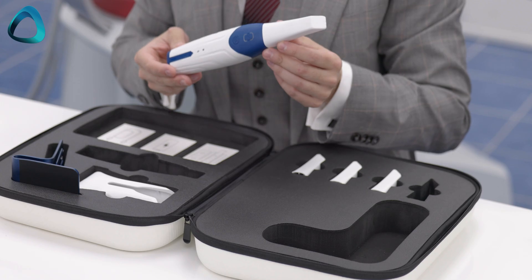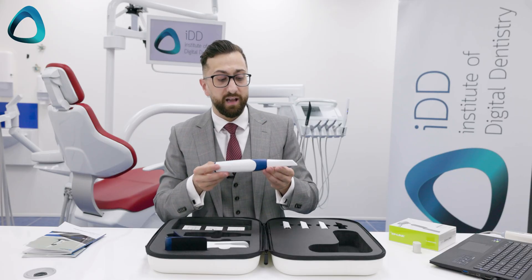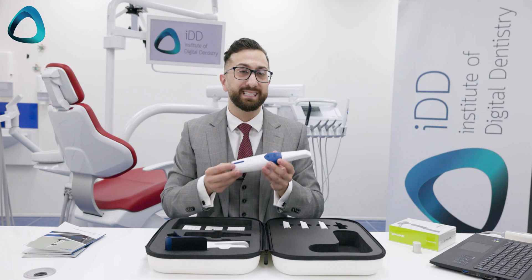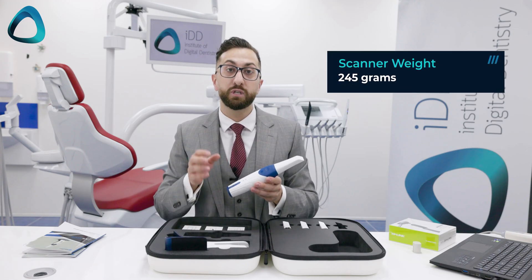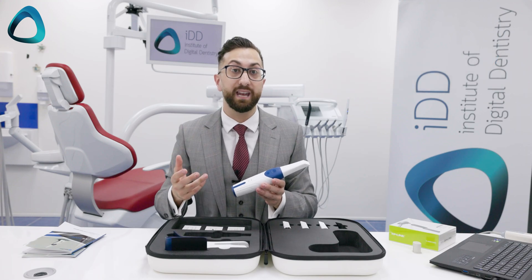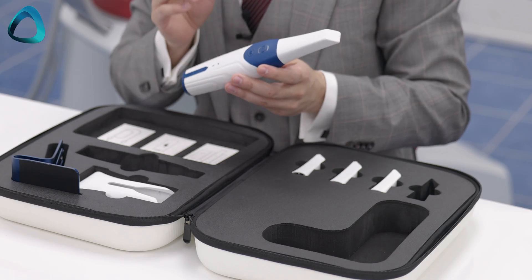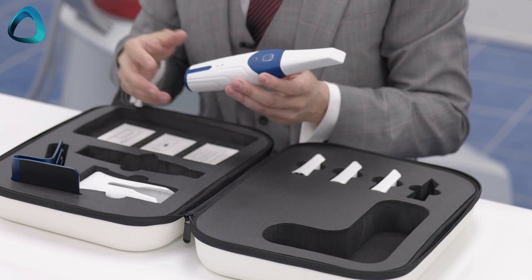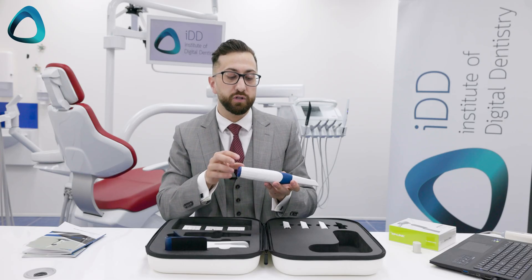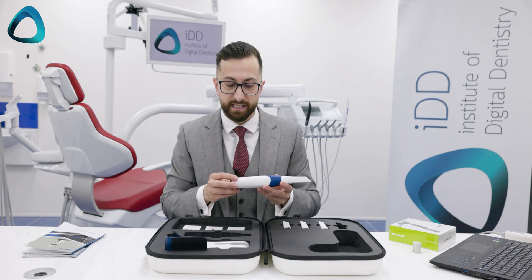This is basically the scanner in all its glory. As you can see, it's quite small and quite lightweight. It weighs exactly 245 grams, which makes it one of the lightest wireless scanners on the market. It is a bit heavier than the AS100, which was around 198 grams, but obviously it's going to be heavier because of all the wireless technology inside.